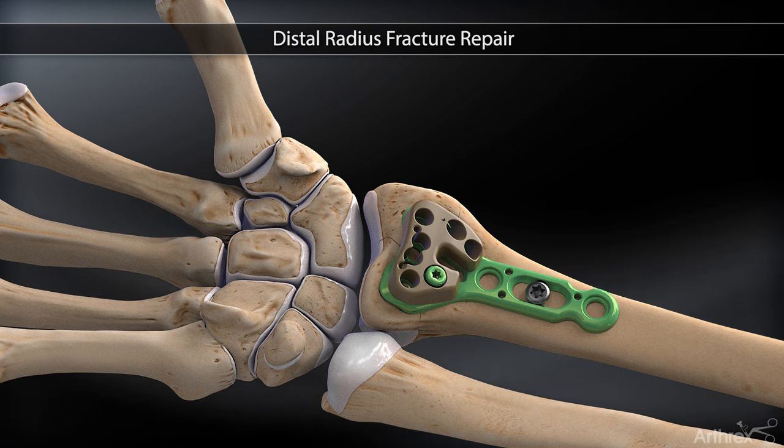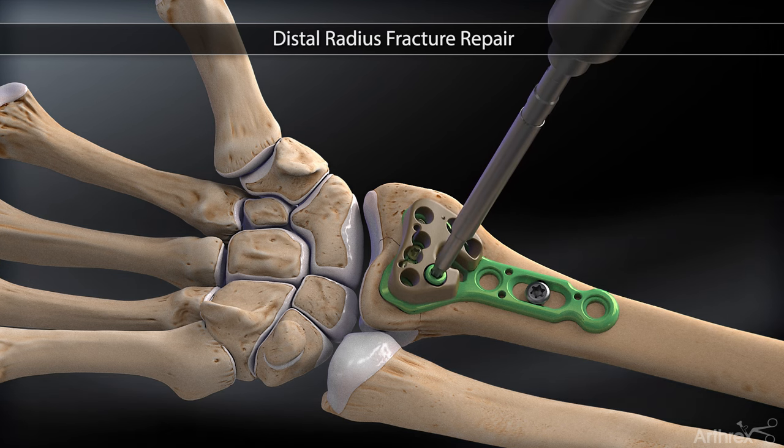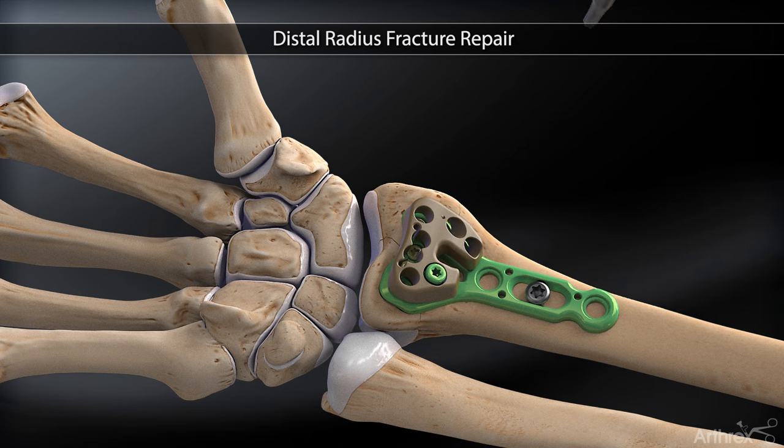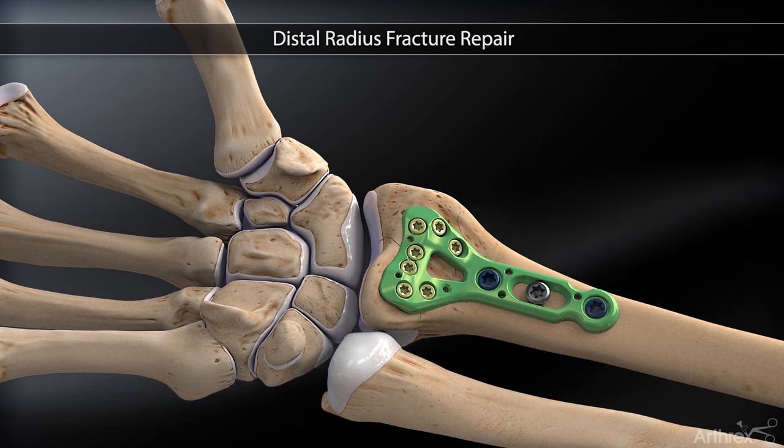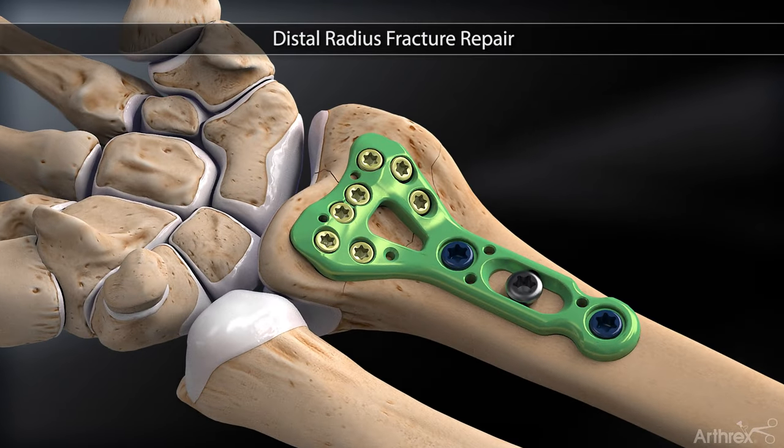These steps are repeated to fill the remaining head holes. The remaining 3.5 millimeter locking screws are placed and the final construct is evaluated under fluoroscopy for satisfactory reduction.